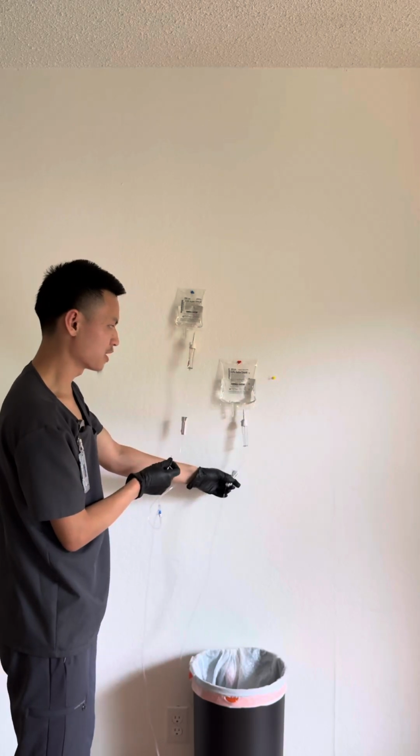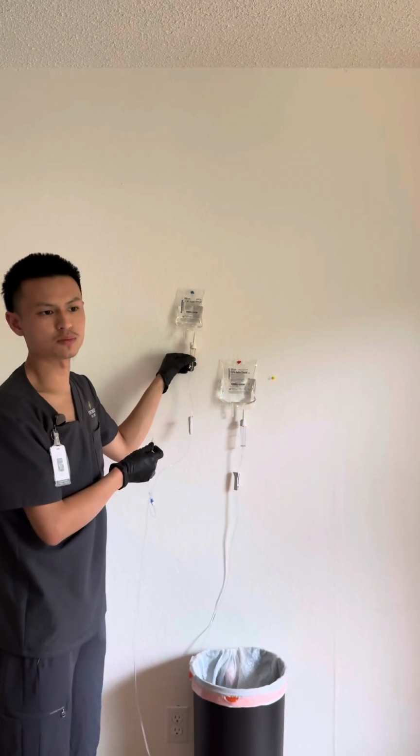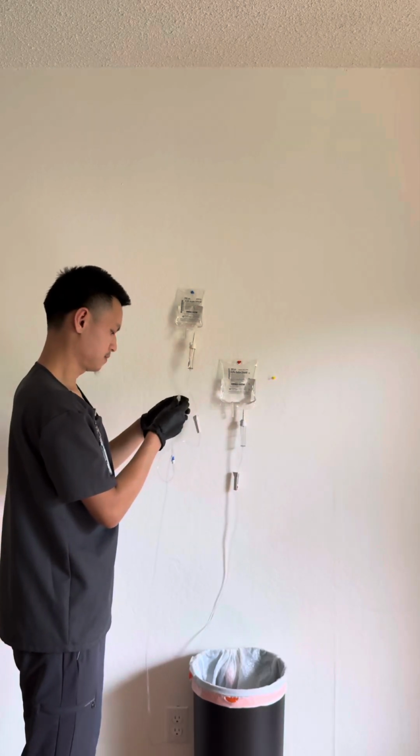This is going to be 38 drips, so that's resumed. I am now going to count. This is going to be 100 drips per minute, so we're going to do that.